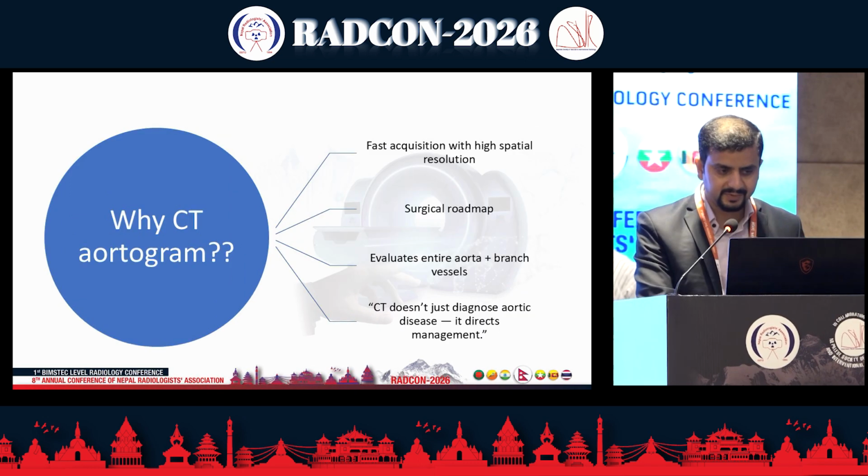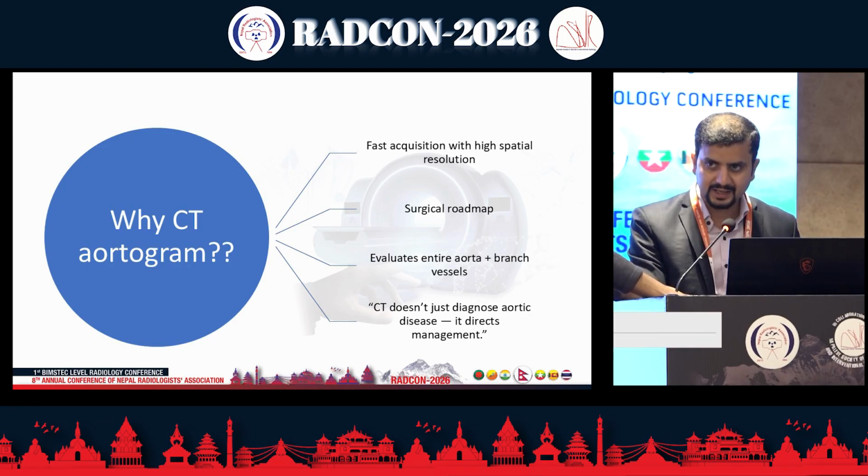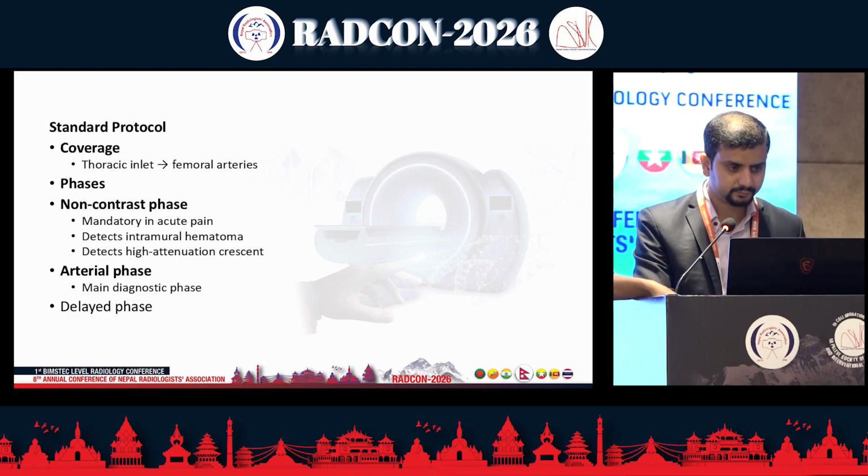So why is CT the preferred modality? Because it gives us fast acquisition with high spatial resolution. It provides the proper surgical roadmap for planning, and it easily evaluates the entire aorta as well as the branch vessels. So CT doesn't just diagnose aortic diseases, it directs the management.